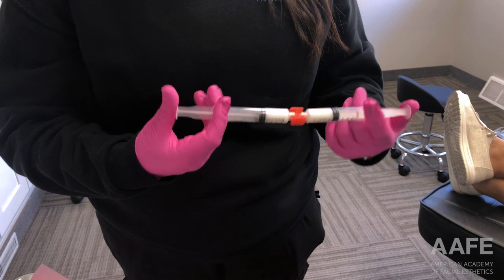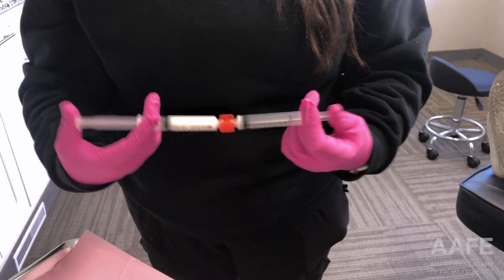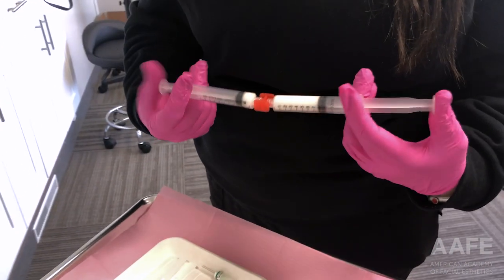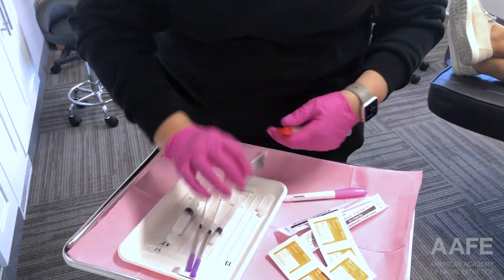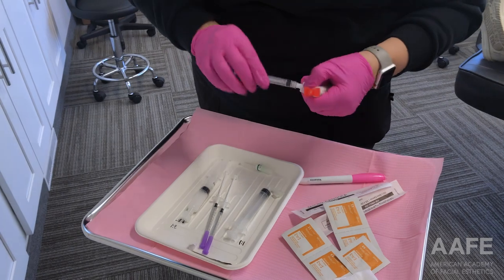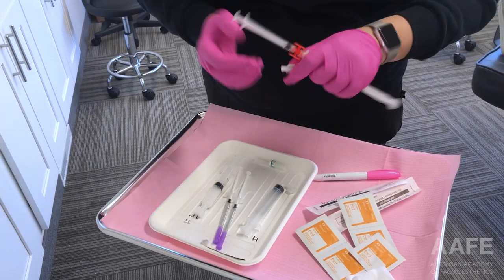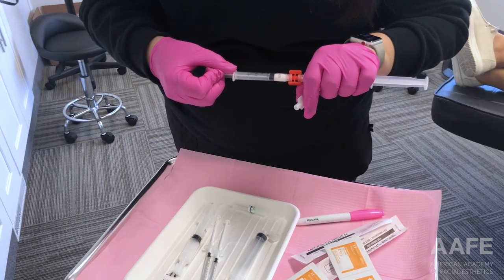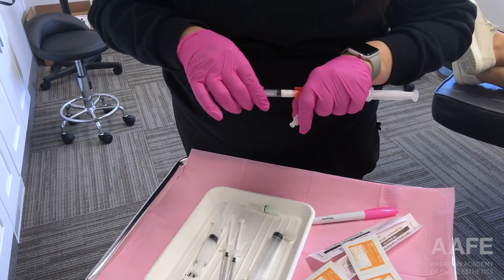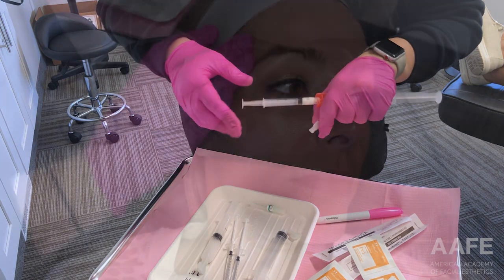Today we are going to review a treatment for hyper-dilute Radiesse in the temples. Radiesse is a biostimulatory filler, which means that in addition to filling and restoring volume, it also stimulates collagen and elastin. When we dilute Radiesse, you tend to lose the volume-filling effect, but you get the biostimulation of collagen and elastin in its place.